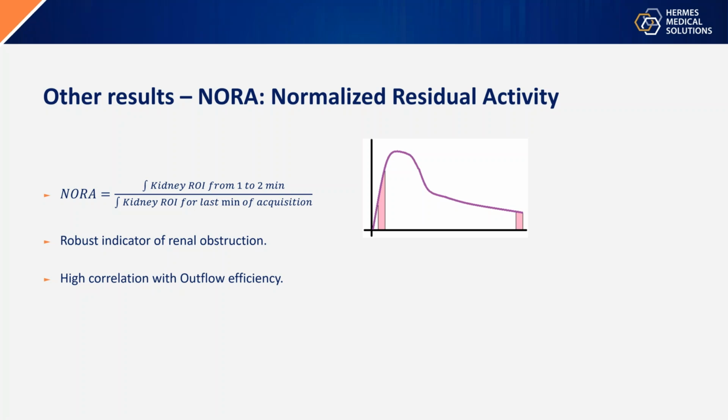You stated that inulin clearance is superior to creatinine clearance for estimating GFR. However, the Gates GFR method employed creatinine clearance as the gold standard for computing GFR. Is that a problem? A little bit of a loaded question there, I feel. I feel so too. I'm trying to think how I'm not going to put my foot in this hornet's nest.